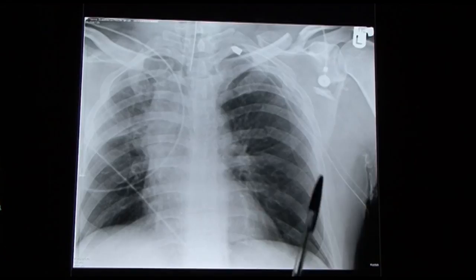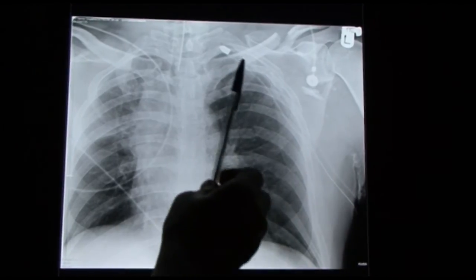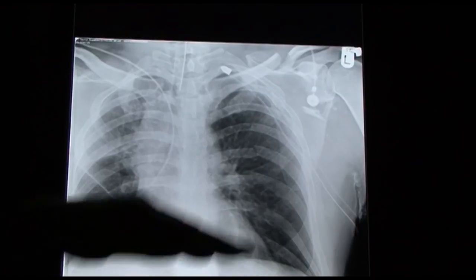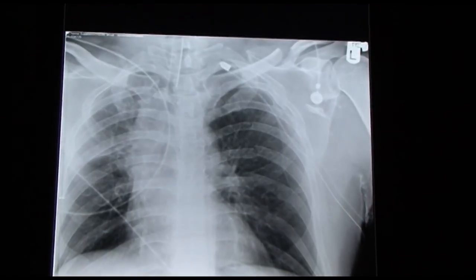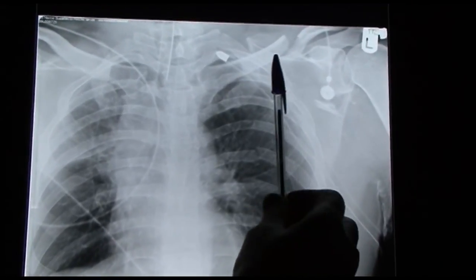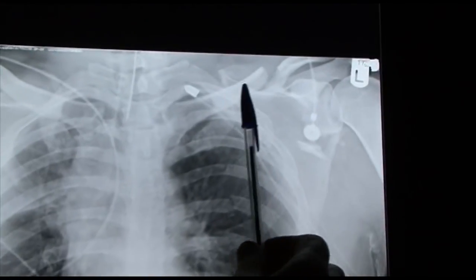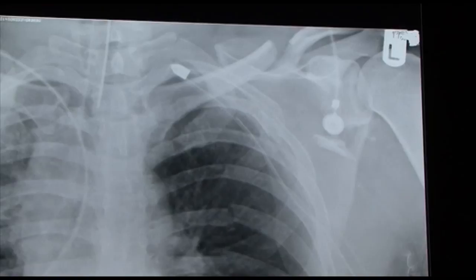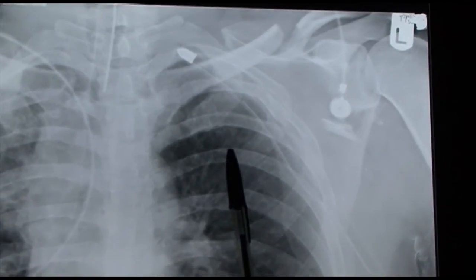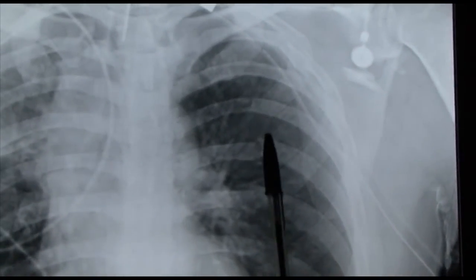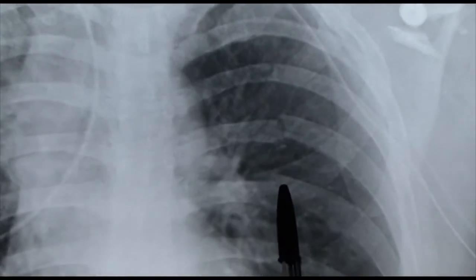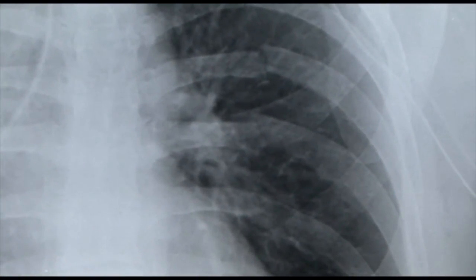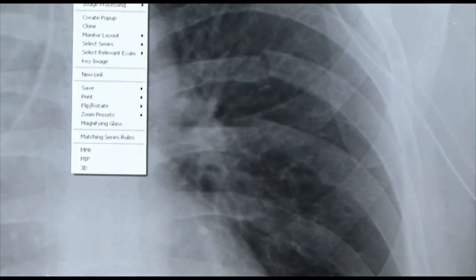We can see this patient has a chest drain going up to drain any air that rises. We can also notice there's a fractured left clavicle — quite a nasty fracture — and very nasty rib fractures here and here as well. Let's just magnify these rib fractures so we can see them more clearly.